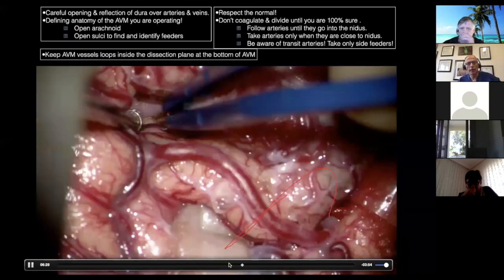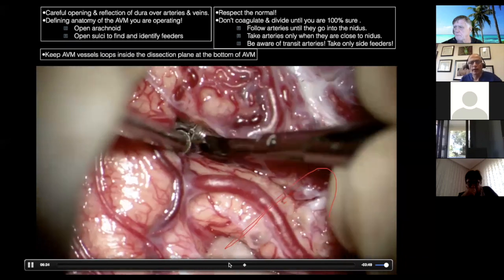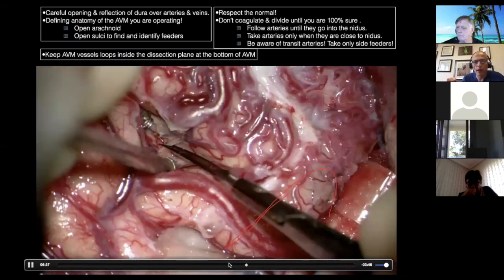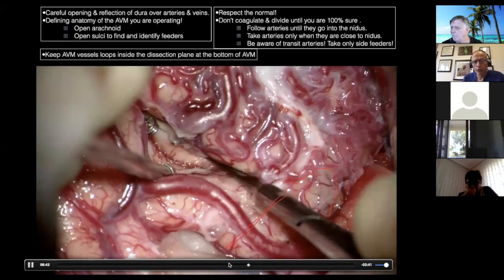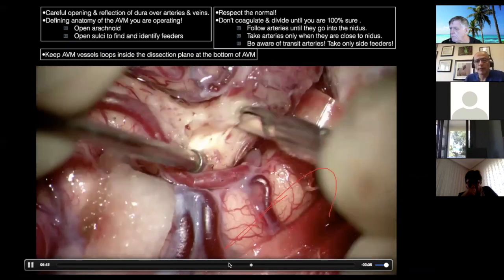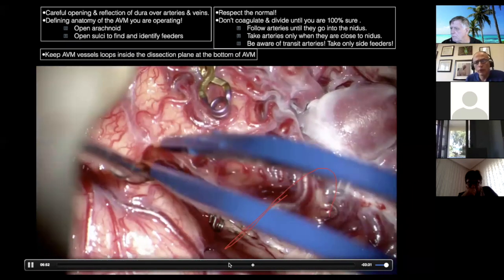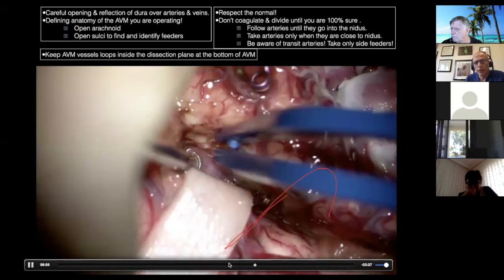Okay, again, now I know, and sometimes I use these small AVM clips. They are good localizers, good anatomical landmarks. So you can use them if you are doing intraop angio, or maybe in a part of the AVM where I left the nidus, so it helps you. You need to keep track of which clip you put where, so you can see them.